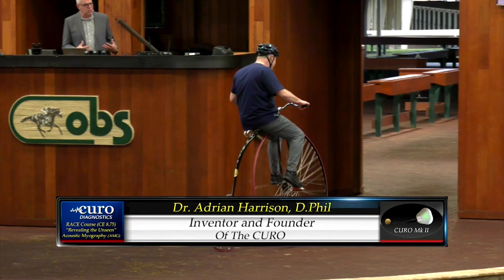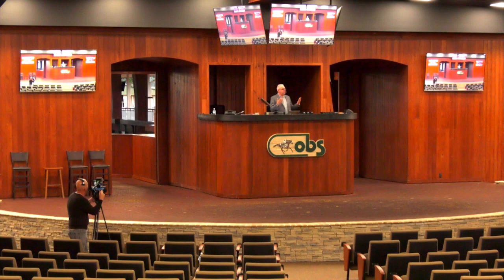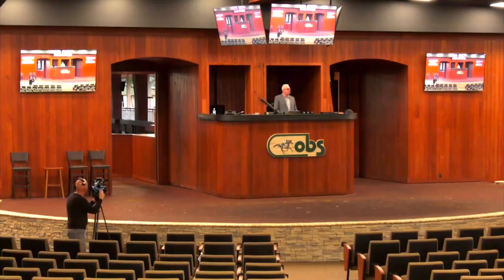That brings up the fact, then, that we can also utilize the same technology to look at prehabilitation of people. Someone who is an athlete and has unequal strength in muscle is now at risk of developing an injury in the stronger muscle, because they use the stronger side to compensate for the weaker side. So you take someone who is a competitive athlete of any sport, and now the stronger muscle is at a higher risk of injury because it's being used more to compensate. In the rehabilitation and sports medicine world, we use the word prehabilitation. This is a tool that will allow us to look at elite athletes or high school athletes and identify whether they are at risk for injury because of the asymmetry in their muscles.